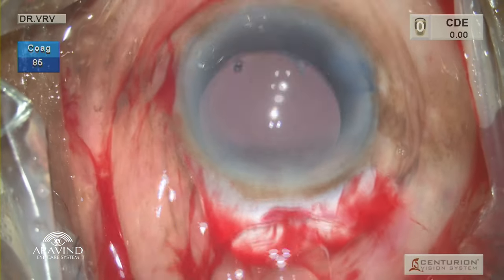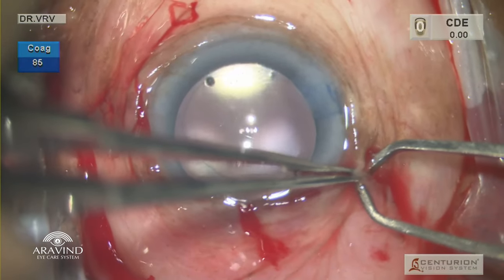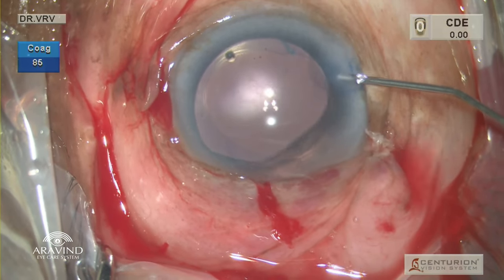The superior rectus is released, the conjunctiva approximated on both sides, and then the cautery is done on the temporal side. Intracameral moxifloxacin is being given.